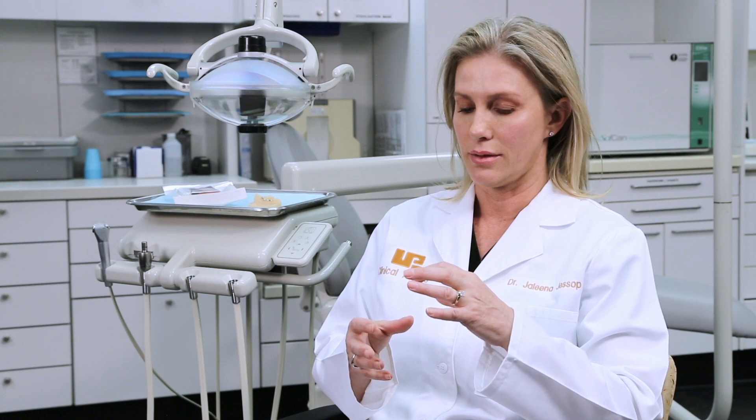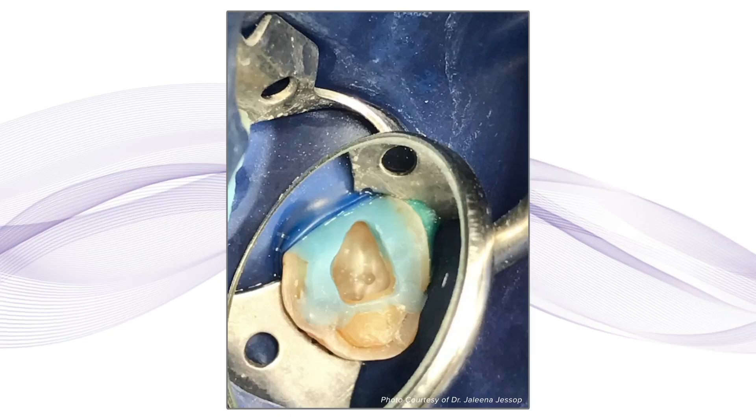The first time I started thinking about J-Temp, I was doing a root canal on a maxillary molar and the lingual cusp — the mesolingual cusp — had completely fractured below the gingiva, and I was really struggling to get isolation before I irrigated the canals. I took one of our ortho products and used it as a barricade for irrigants, but also to help support the cusp that was there before I put a clamp on, and it worked out really well.